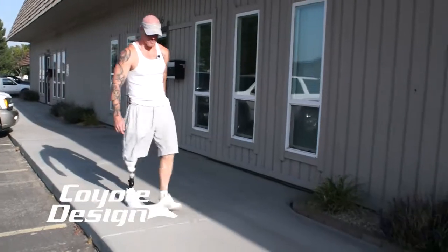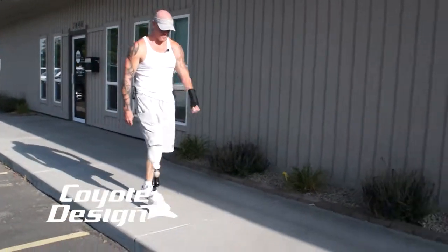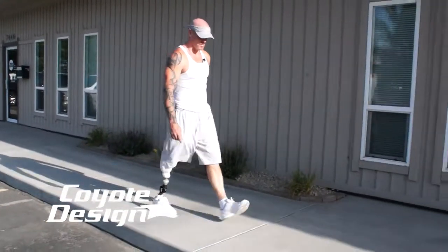Two weeks after you guys made my first socket, all the sores were gone. I didn't have any pain anywhere when I started running it. So just the comfort level is the biggest difference that I see.